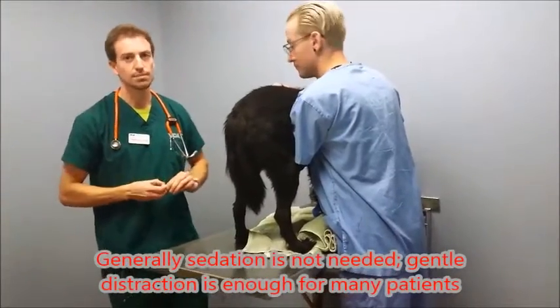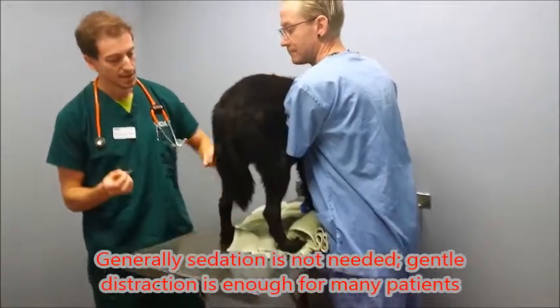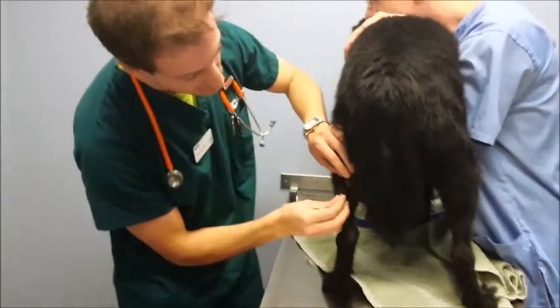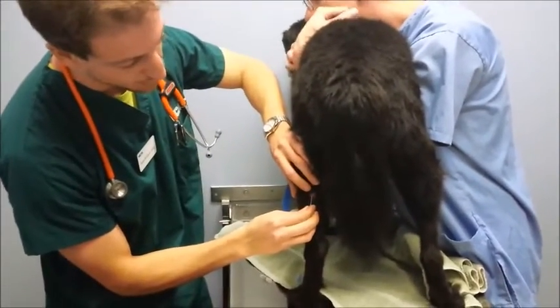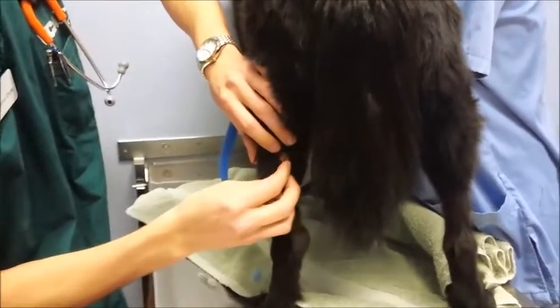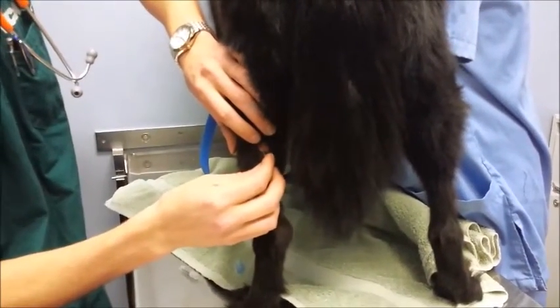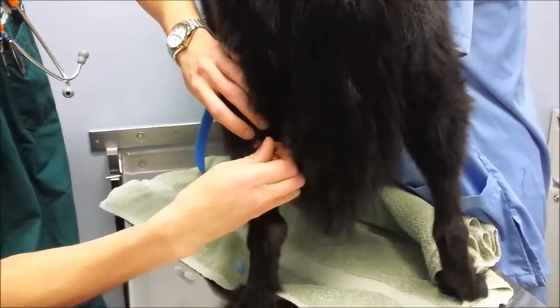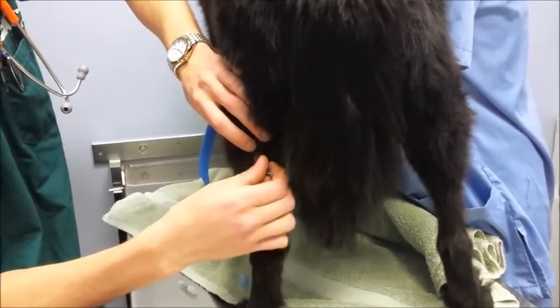This is a small needle — people get tattoos all the time. I'm just going to take the needle and gently insert it into the actual mass here, and we'll just poke around and dig around a little bit to try to get some of the cells into the hub of the needle. Sometimes I'll poke several places. A small amount of bleeding is expected and just fine — no big deal.